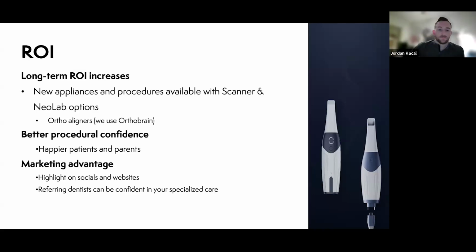Yeah. So as far as clear aligners go, anything with open architecture or open source, any company, you are able to use. So a few of those, Clear Correct, I know Henry Schein, and then also Angel Aligners. Those are some that I've spoken with who've used those. But any company that has open architecture, open source, which there are so many out there, just about most of them are. The main one that is not is Invisalign, that is closed source. So that's really the only main one you'll run into or hear mostly about. But the vast majority of them out there are open source, open architecture. So you have an abundance of options as far as clear aligners go.